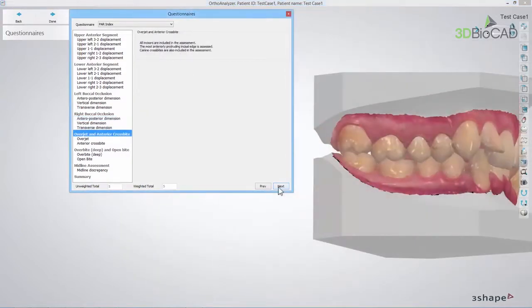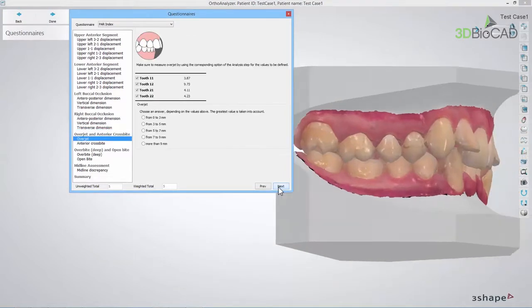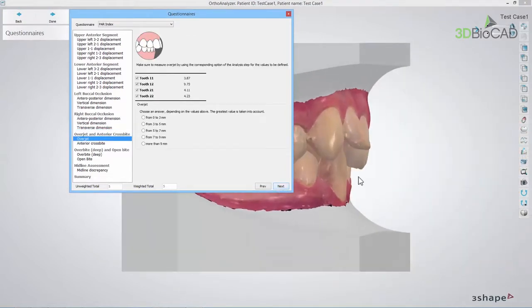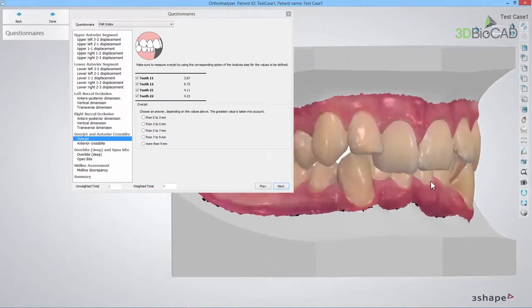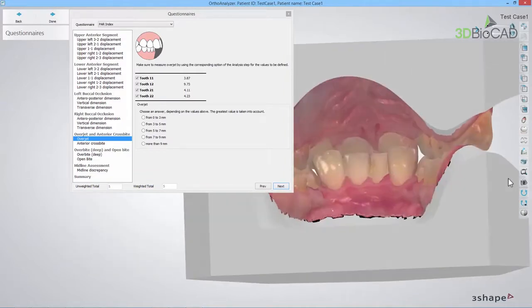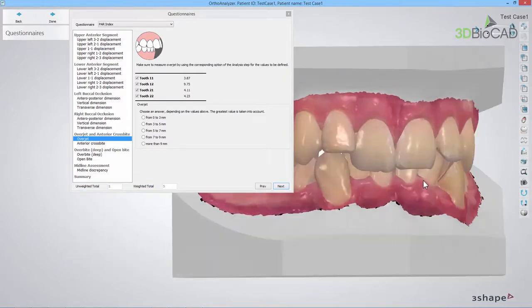In the Overjet and Anterior Crossbite section, all the incisors are included. Start with the Overjet, where you simply select the answer that corresponds with the highest Overjet value shown.